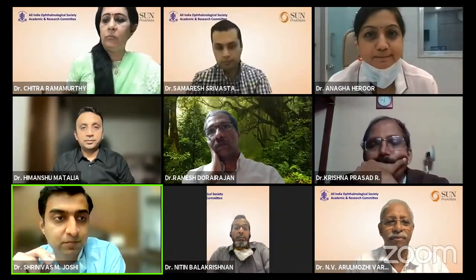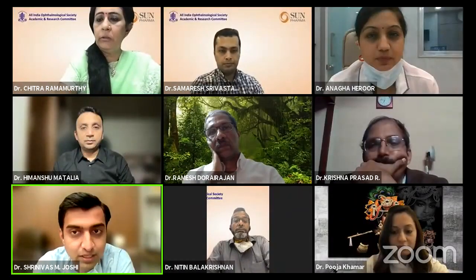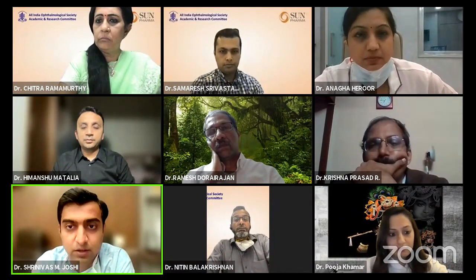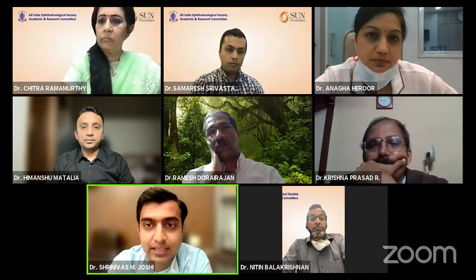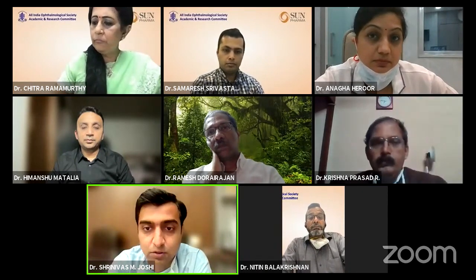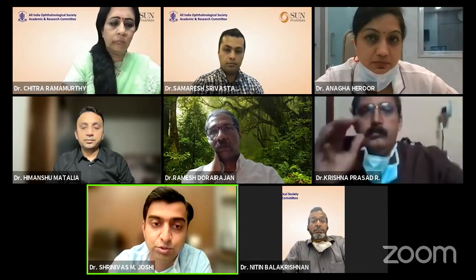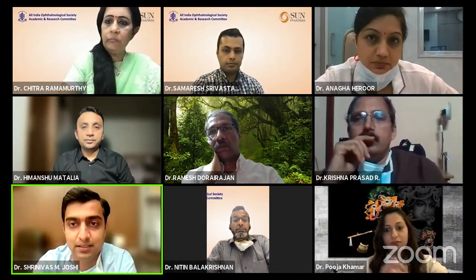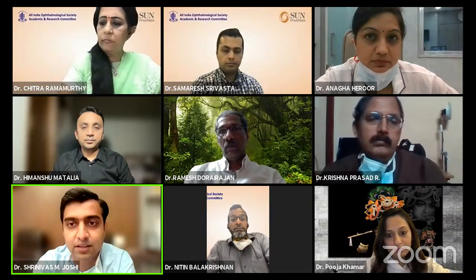Coming to the question Dr. Anaga asked, I want to ask the panelists here. What we used to do when it's a hard cataract, silicone oil filled eyes, when IOL biometry was not possible. If the retina is settled, we can definitely take out the oil and calculate IOL power with any of the ultrasound methods and then go in for the secondary IOL implantation. Most of the time, what we used to do is remove the cataract, remove the silicone oil as well, and then it becomes like any other normal routine patient, and then we can go in for the IOL power.